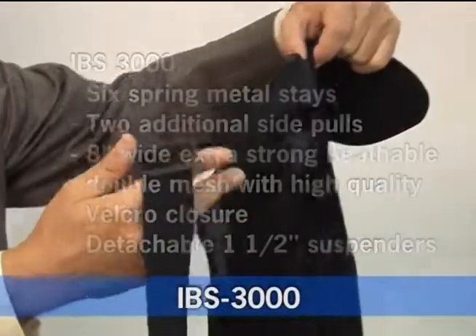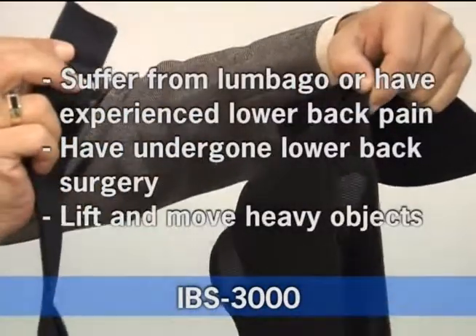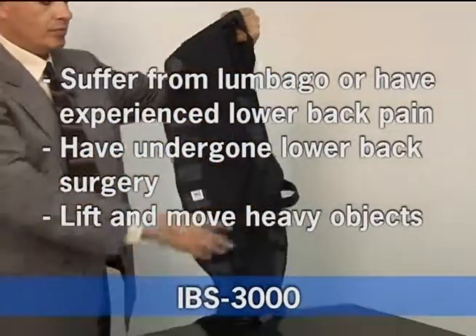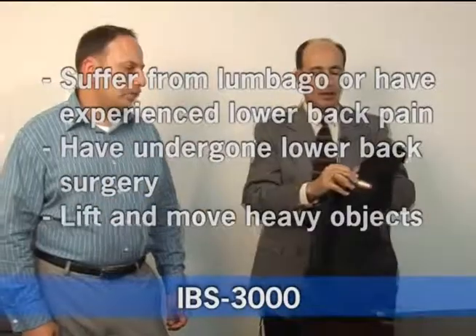One of the unique features of this belt is the detachable one and a half inch suspender. The belts come in beige and black. These belts are recommended for those who suffer from lumbago or have ever experienced lower back pain or have undergone lower back surgery.